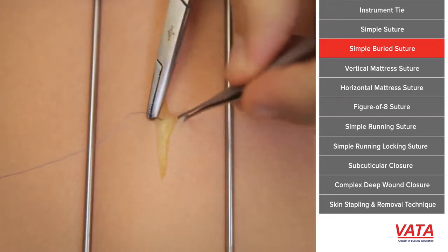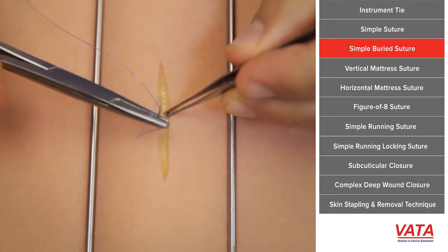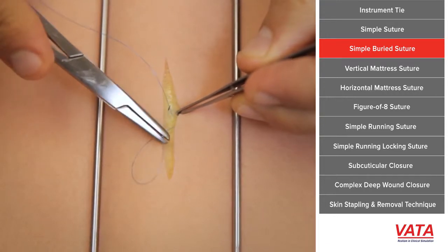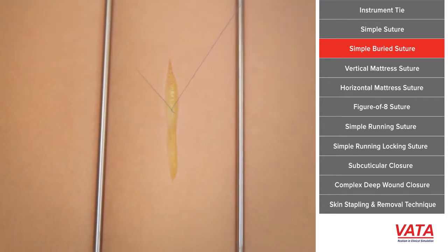The key here is you want to get some of the deeper tissues. Here you see in the model we can get some of the deeper dermis — there's actually a little piece of mesh in that deep dermis. We want to grab that deeper stuff, come out superficially, so we're starting deep, and then we enter superficially and end deep.